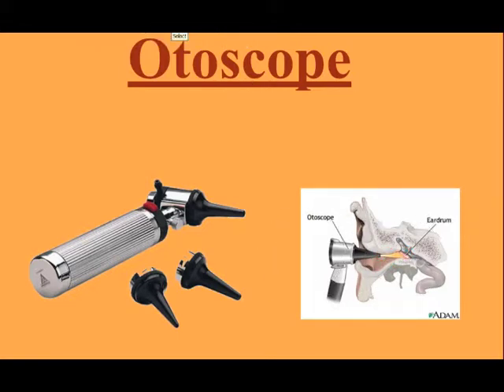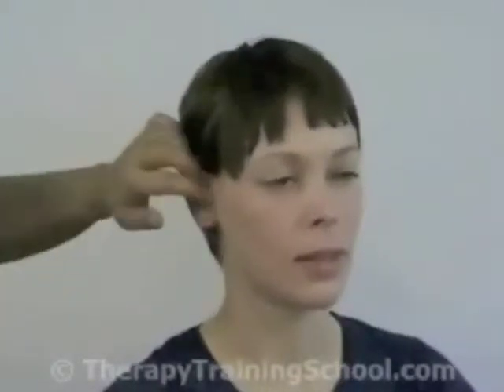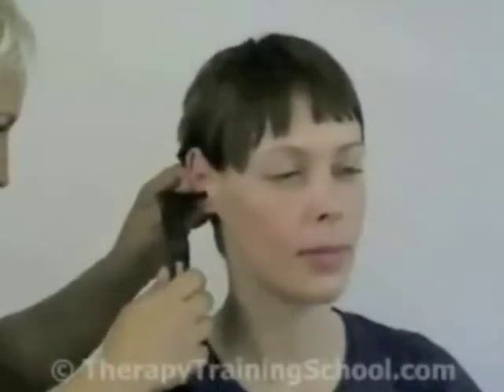But again, this does not hurt. The biggest thing that you have to worry about is staying still, and it does tickle a little bit when the doctor sticks it into your ear. You got to try to stay still and just do what he says and follow directions, and make sure that you're not wiggling around too much. But other than that, this is a very great tool or instrument that the doctor uses on your normal checkup. Watch how patient this person is as they let the otoscope go into their ear, their head stays still, and the doctor can see everything that they need to see.